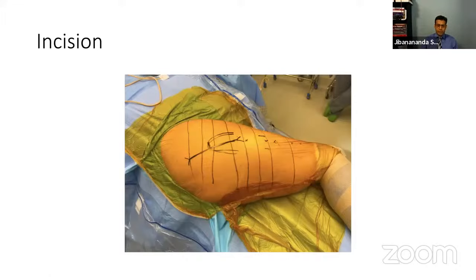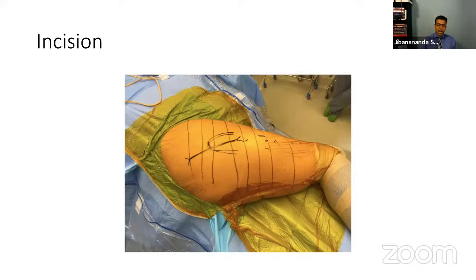This is my typical incision. You can make it smaller or bigger depending on the size of the patient. I mark the greater trochanter. My incision is usually half above the tip of the trochanter and half below, angled posteriorly about 20 to 30 degrees. For bigger patients I incline a little more posterior; for smaller patients, a little straighter. I keep it on the posterior third of the trochanter.